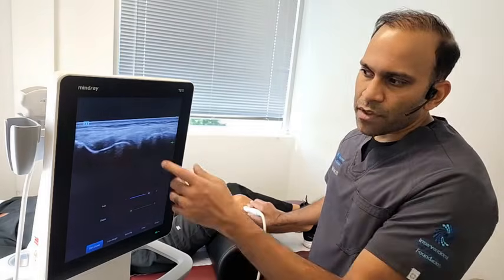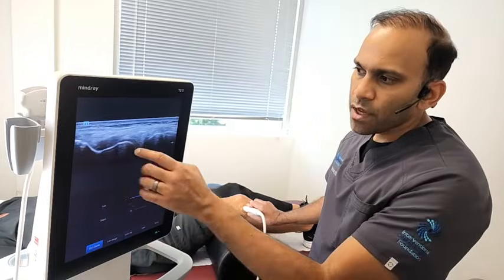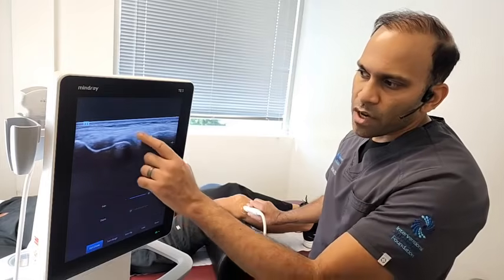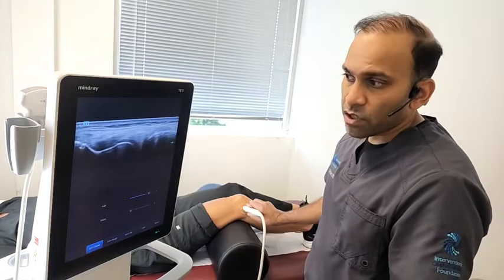This is actually the meniscus right here. So this is the thigh bone, the femur. This is the lower leg bone, the tibia. And this triangle-shaped structure right here is the meniscus. Actually looks really good.